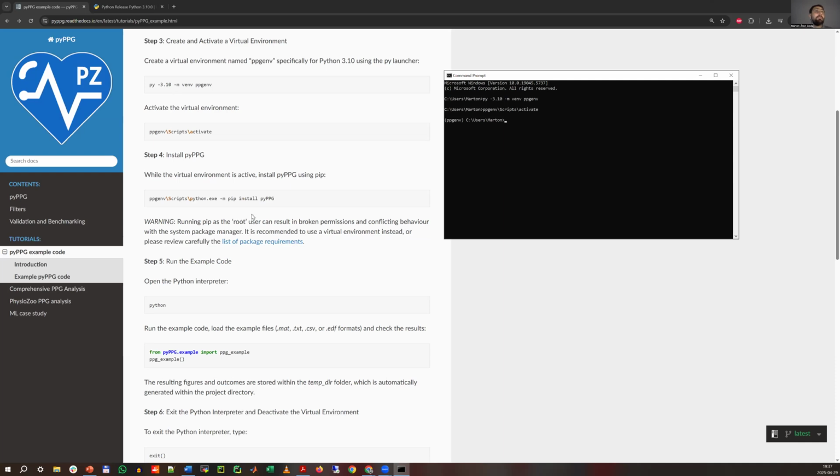If you are ready with this one, the next step is to install the pyPPG toolbox itself.